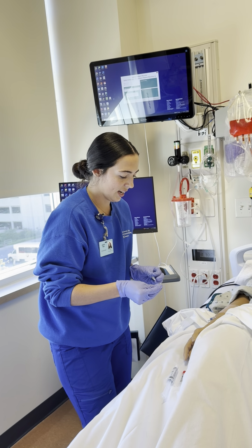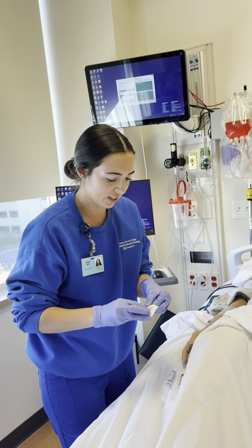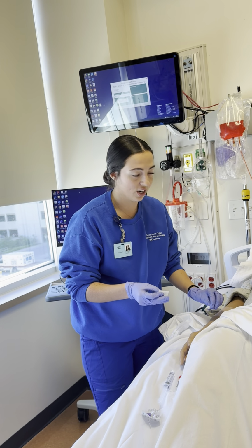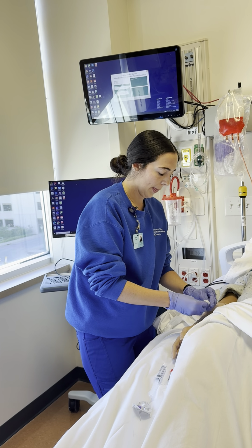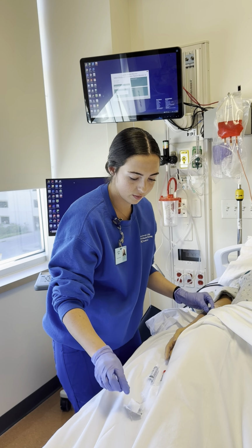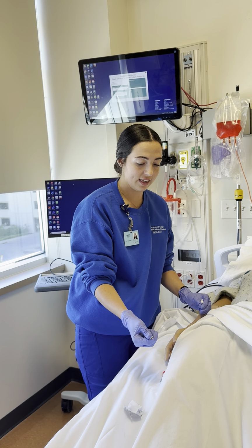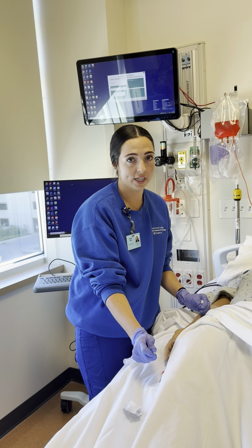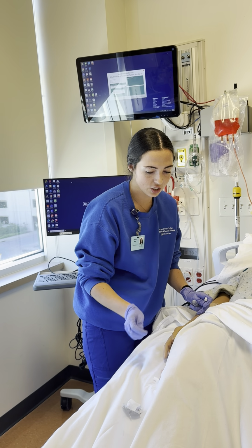So the first thing that I am going to do is I'm going to take an alcohol prep pad, and I'm going to wipe down this area for 30 seconds. So, this down, 28, 29, 30, release that. Okay, so now I'm going to just make sure that the peripheral IV that we have here is working properly. So I'm going to go ahead and open up my sterile flush.